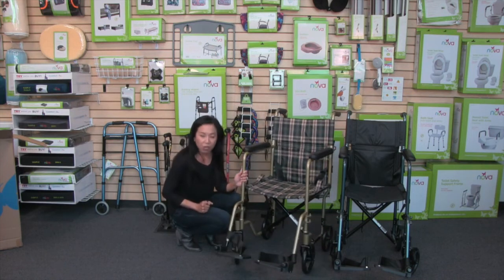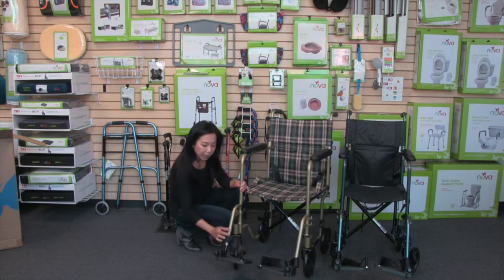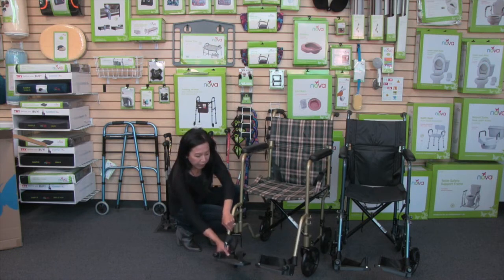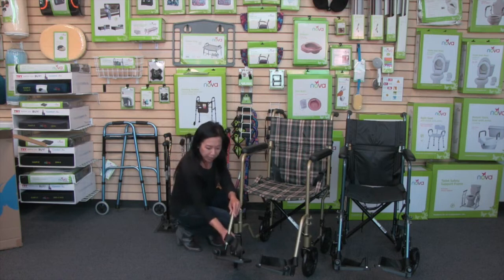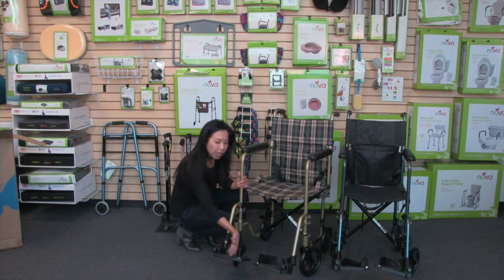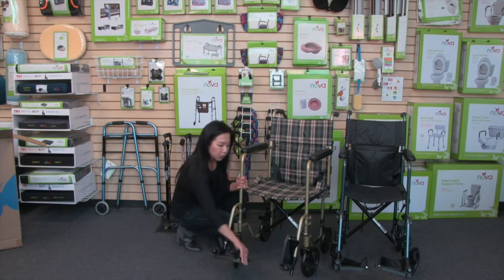These footrests are adjustable. You'll see a knob on the back of the footrest — release that to the left to unlock it. You'll then see push buttons, and you can adjust the footplate to your desired height so it's comfortable for the user. Once you have it at the right height, turn the knob to the right so it's nice and tight. These footrests also come with heel loops, so the user can rest their heels and feet on the footplate. The footplate also flips up, making it easy for the user to get in and out of the transport chair.